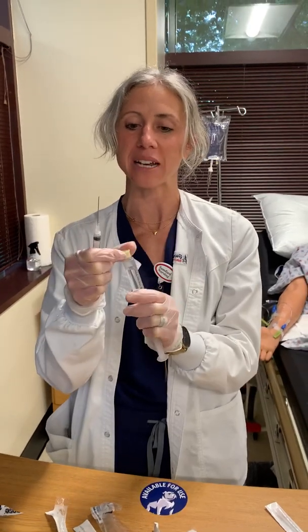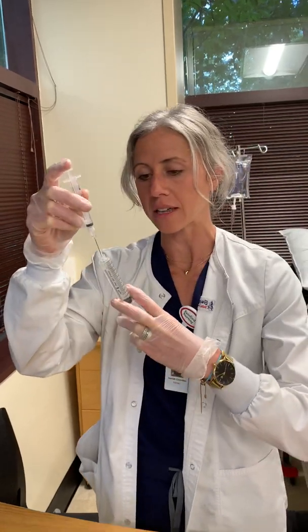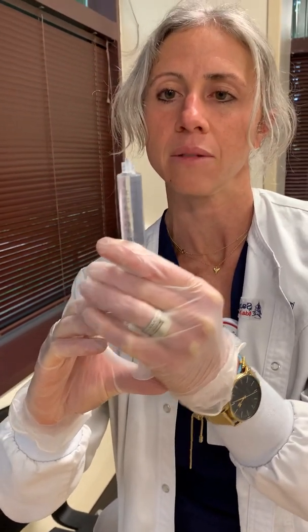Needle. I've got plenty of space. I'm going to take this off, okay? Got my needle. There's a nice little hole right there, which seems like magic to people. So I'm going to push my drug into there. Once I've got my drug in, I'm going to very carefully move mine all the way up. Do you see any air bubbles?